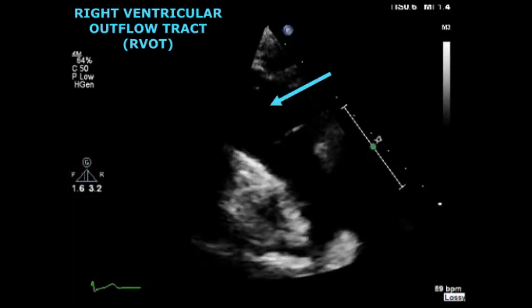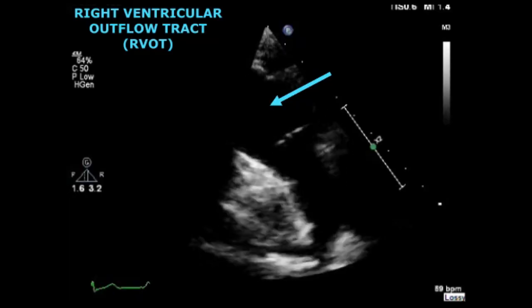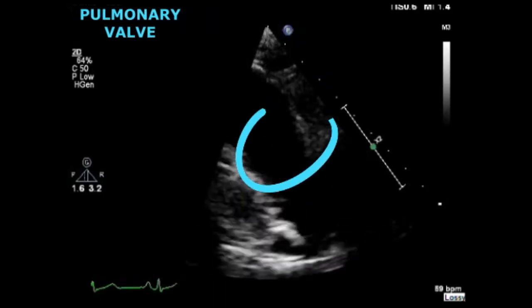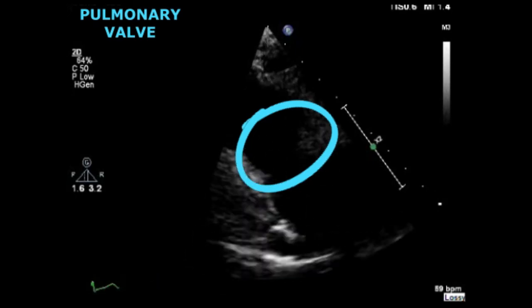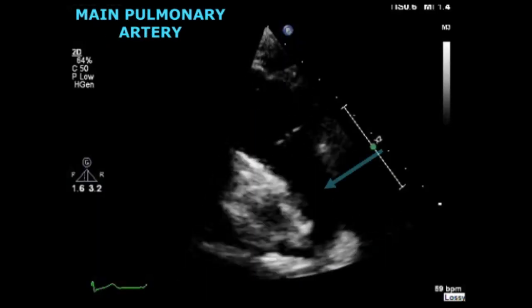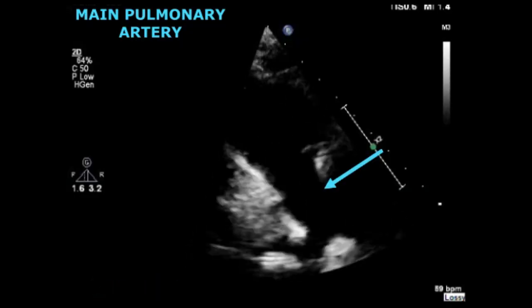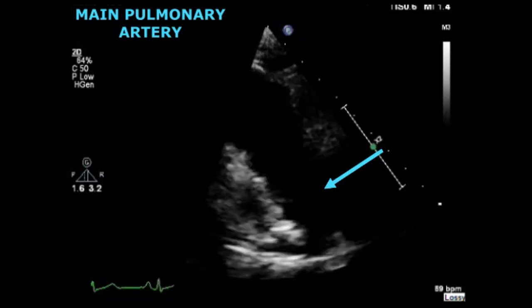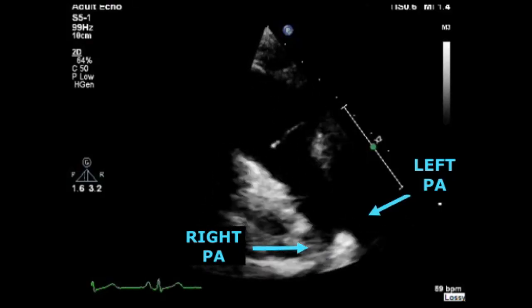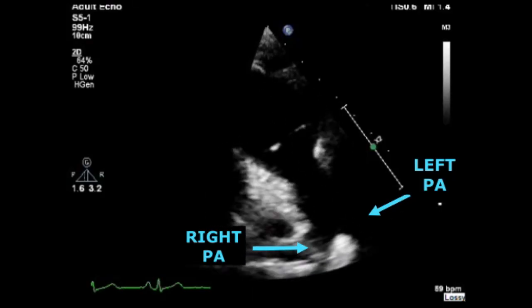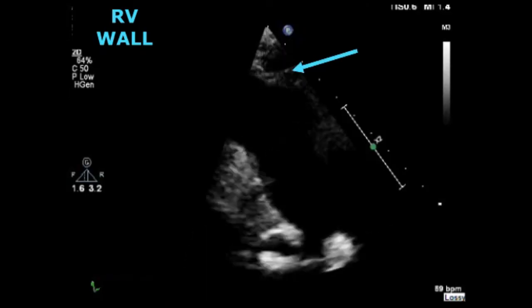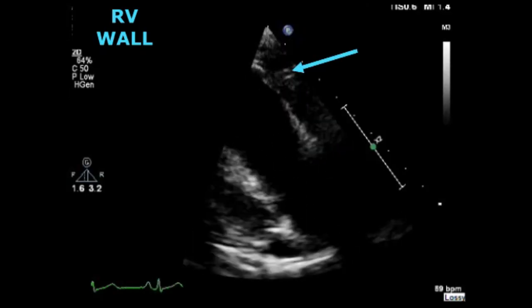Now continuing to the right ventricular outflow view: at the top you can see the right ventricular outflow tract. After the RVOT you can visualize the pulmonary valve. Under the pulmonary valve we have the main pulmonary artery, which divides into two branches. On the right hand side you will be able to see the left pulmonary artery, and on the left hand side you can see the right pulmonary artery. To finalize, at the top we can see a small segment of the right ventricular wall.